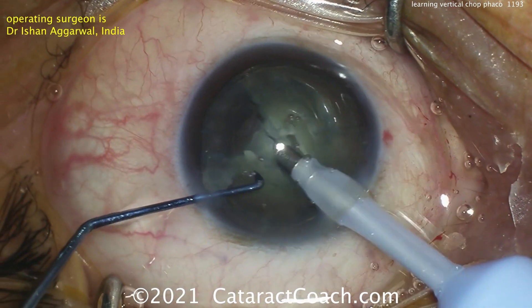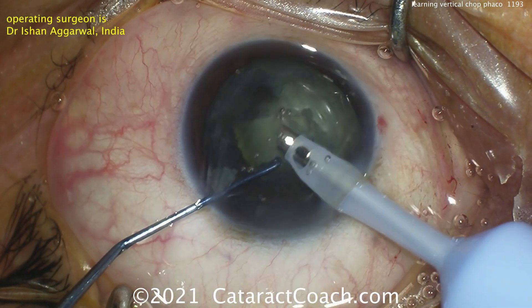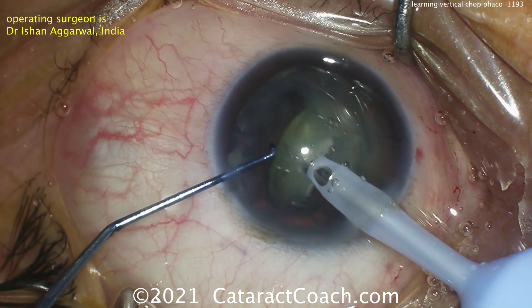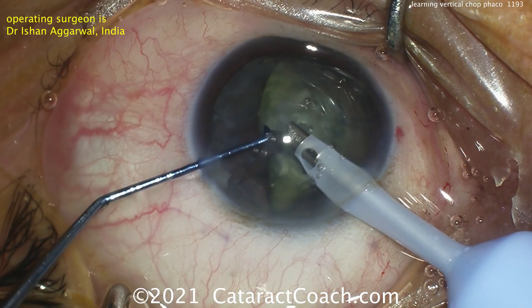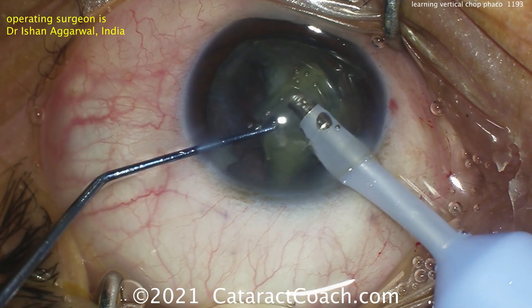Vertical chop is definitely a nice technique to learn. Remember, the patients need to have at least some degree of nuclear density. Once there are other pieces up, you don't have to do vertical chop — you can do any other kind of chop. Just split the pieces apart, claw them apart. And that was accomplished very well.